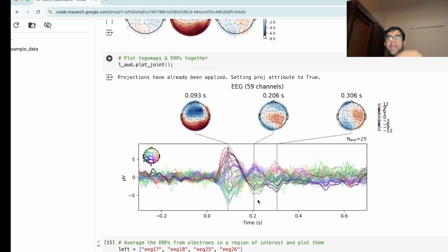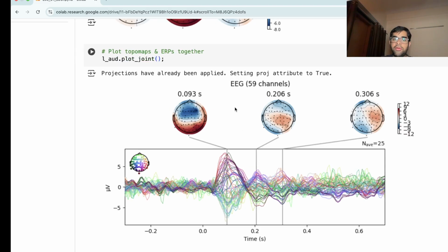In geography, you might have heard this term, but we use it to know how a map of electrodes and their responses looks like. Topography is nothing but how a landscape looks like. You have isoclines and all. That is a geographical topo map, but this is a neuroscience topo map.